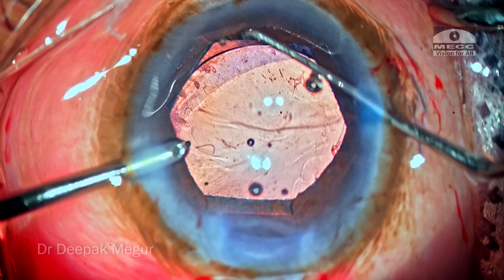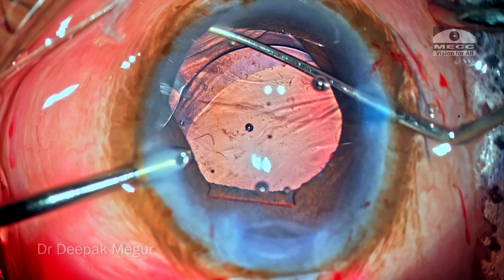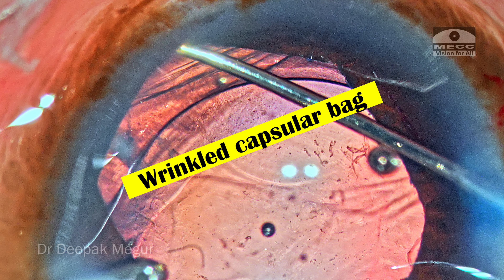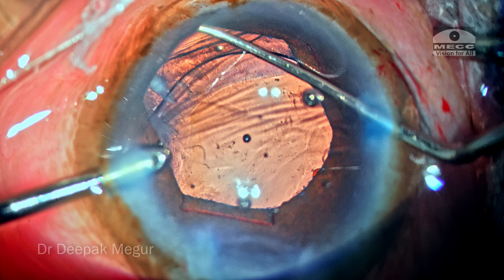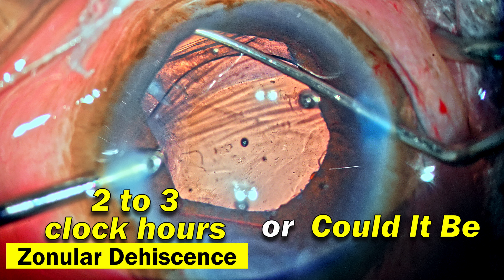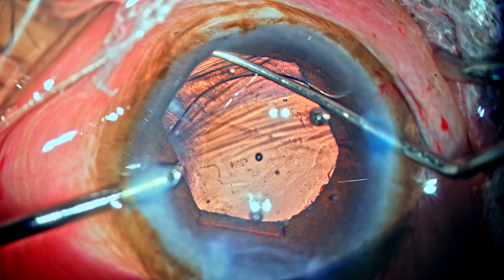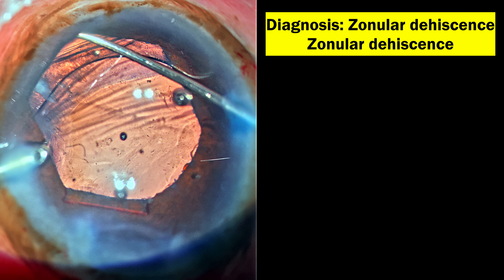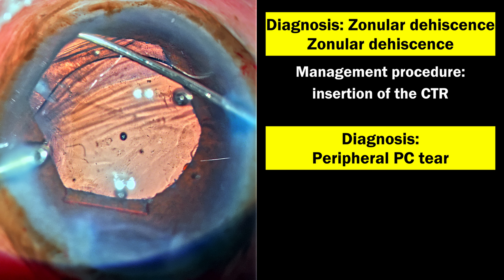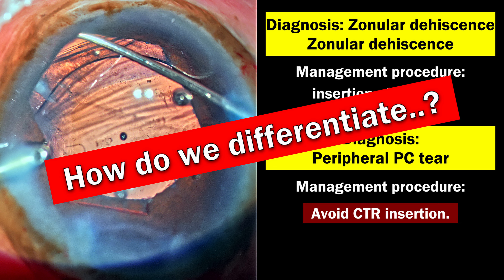Using irrigation in my left hand, I'm using a Sinskey hook to retract the iris in that quadrant and inspect what's actually wrong. We can see a bare area beyond the capsular bag and the capsular bag is wrinkled. The first diagnosis is a two-to-three clock hours zonular dehiscence, but could it be a peripheral posterior capsule tear as well? My mind was having this discussion because the management strategies are going to be entirely different — CTR for zonular dehiscence, but CTR insertion would be disastrous with a peripheral PC tear.